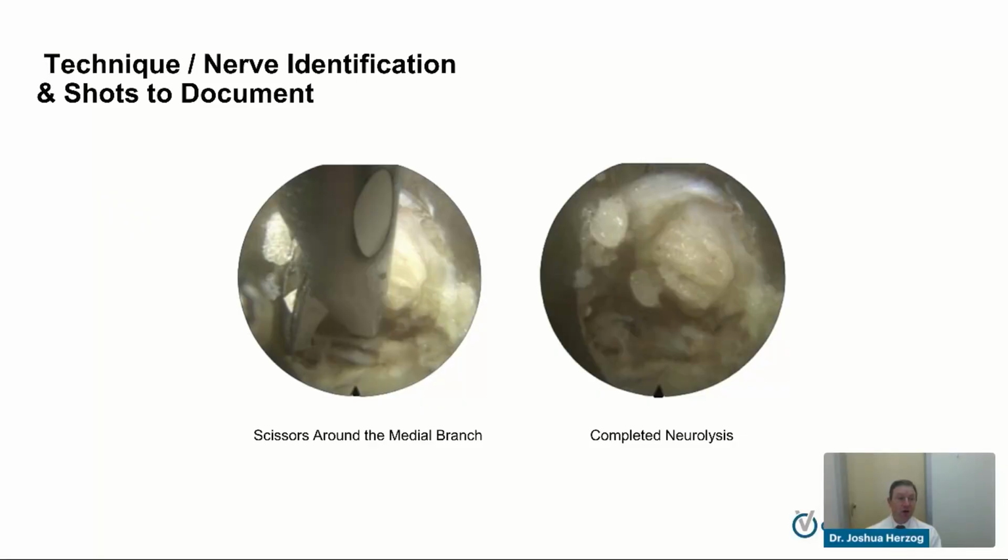So you can appreciate how very small that nerve is. It's 1 to 2 millimeters. It's tiny, but of course it's blown up. So we're looking at it, but that nerve is running left to right between those scissors. And then once we cut or ligate that nerve, then it's no more. Oftentimes we'll cut or segment it out, take a piece, and then burn each edge so that it doesn't ever reunite or grow back.